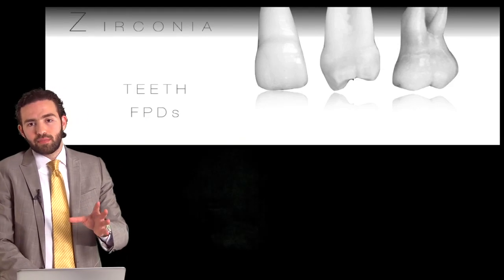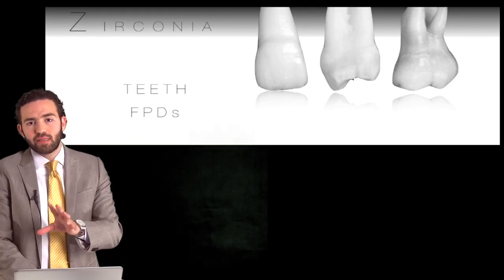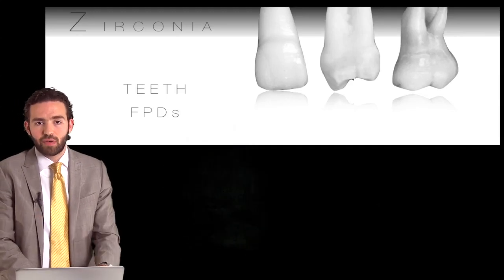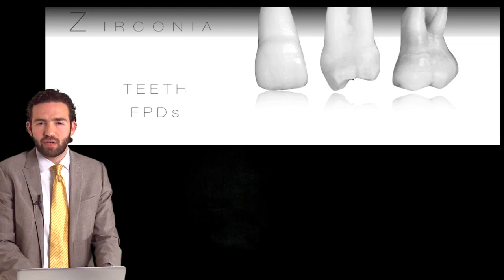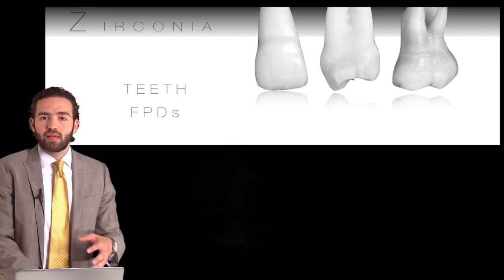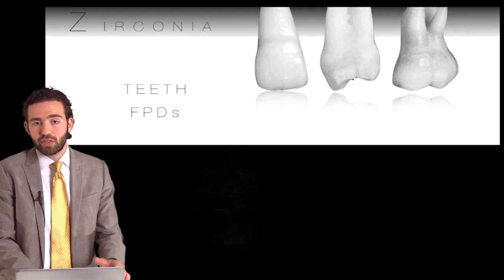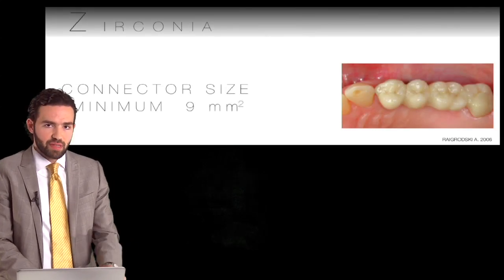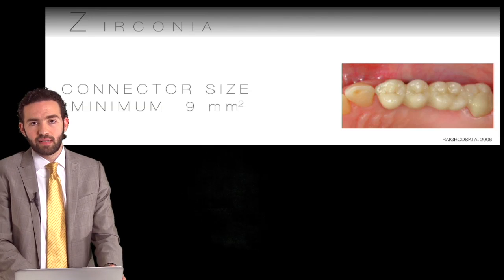So we covered the single unit teeth in terms of translucency and opacity of zirconia restorations. But what about fixed partial dentures? And how can we apply zirconia into bridges? And is that really possible? The main thing with fixed partial dentures is really the connector size.